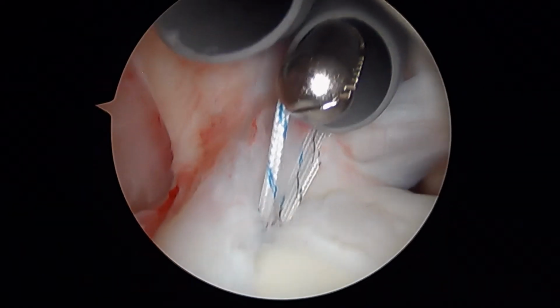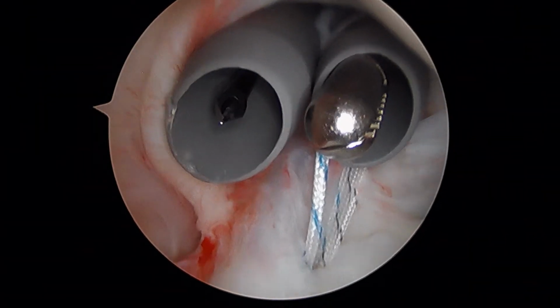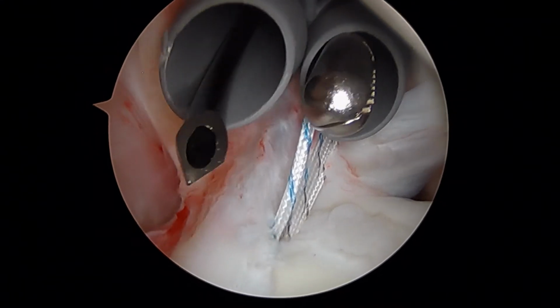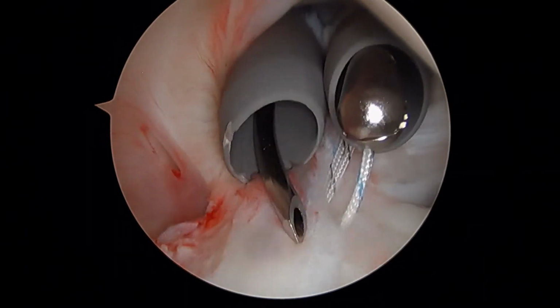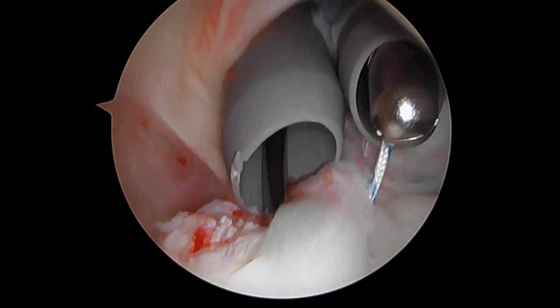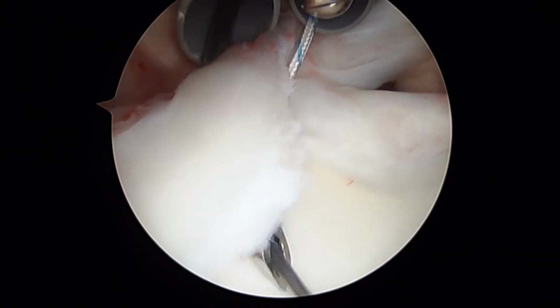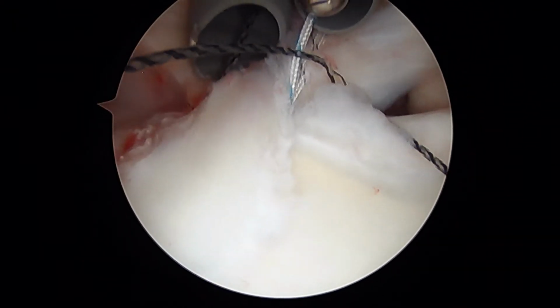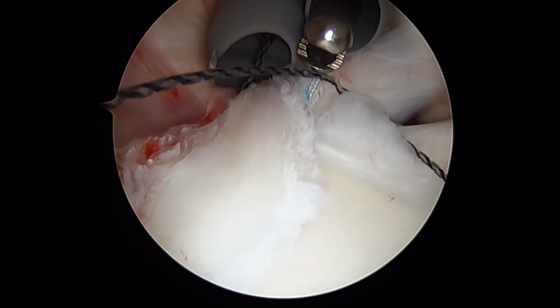Okay, so we've placed a double-loaded anchor. This is our suture hook coming in here. It's loaded with a black wire called the Super Shuttle. We're going to pull back and basically do a very similar type of stitch to what we do for a SLAP repair, because we're doing the same thing. We're repairing the labrum. There's the first pass. We'll feed the relay through a bunch, and then we'll back the needle out. We'll retrieve it here.